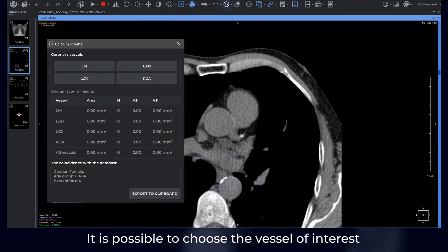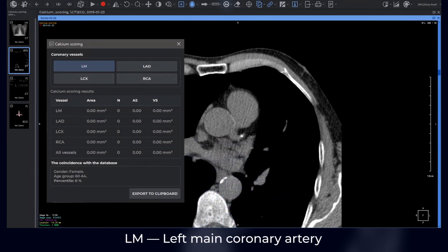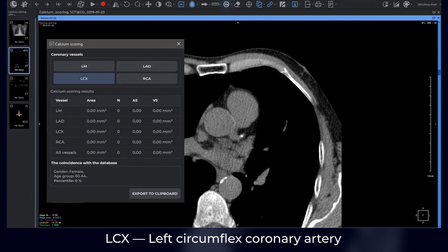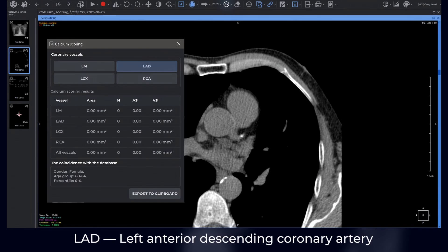It is possible to choose the vessel of interest: left main coronary artery, left circumflex coronary artery, right coronary artery, or left anterior descending coronary artery.